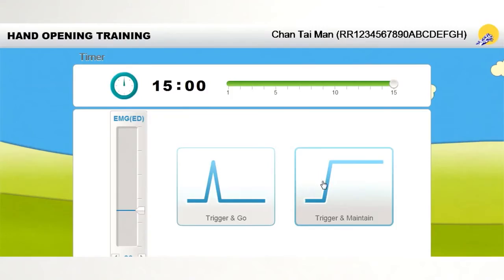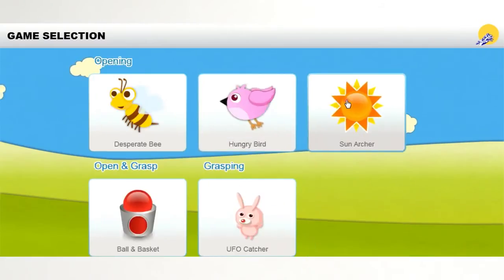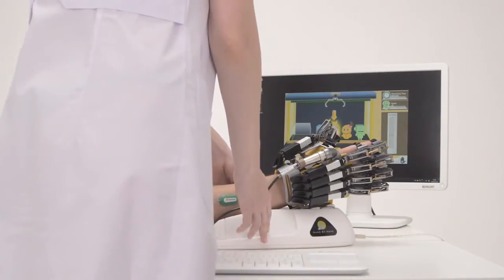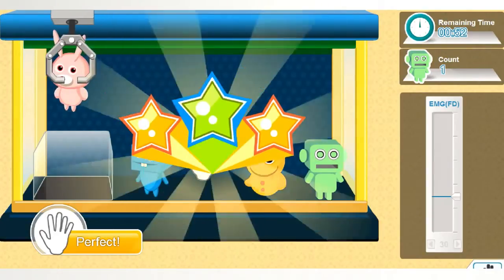Hand of Hope has passive and active training modes for hand opening and grasping. Five different games with four difficulty levels help the patient make the rehabilitation process more interesting and fun with audio and visual stimulation.